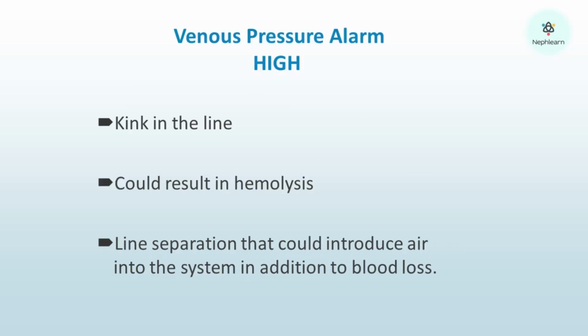A high venous pressure could also indicate kinking and can result in hemolysis or air introduced into the system.